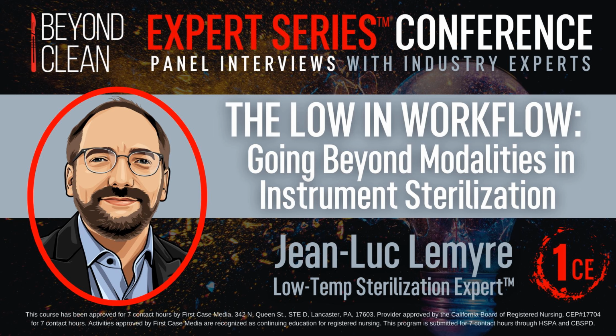That's really helpful. And so when you're talking about doing that extra due diligence of making sure that the instruments can go through that sterilization modality, that goes beyond just the sterilization method listed in the IFU, right? If you were pulling your stainless steel ortho instruments for a total knee revision, those stainless steel instruments may be validated to go through the sterilizer, but you also have to think about the density of how they're packed in there and how heavy they are as well, right? Correct. There's typically a weight requirement for every sterilization cycle on low temp.